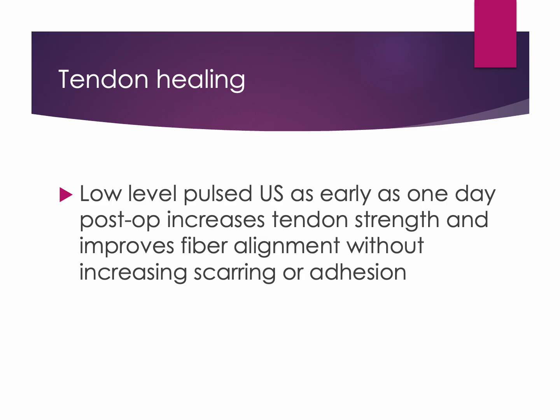Research shows that low-level pulsed ultrasound can improve tendon strength and alignment early in healing without increasing scar formation. Pulsed therapeutic ultrasound is thought to assist tendon healing by enhancing fibroblast activity, collagen synthesis, protein production, and cell membrane permeability, all of which may support the tendon repair process.